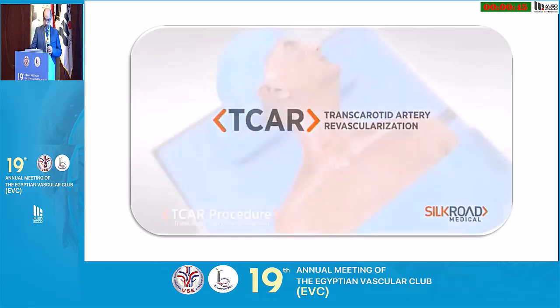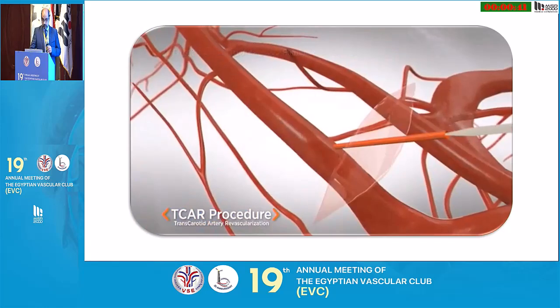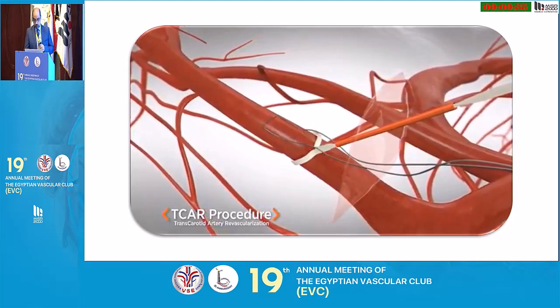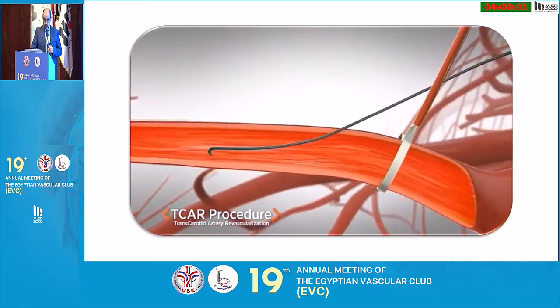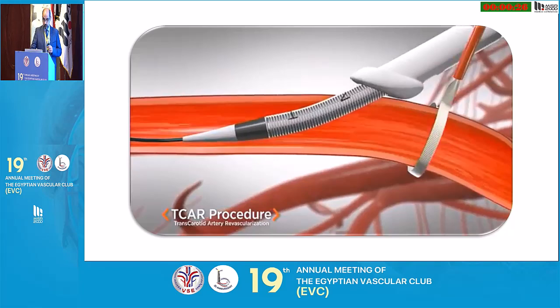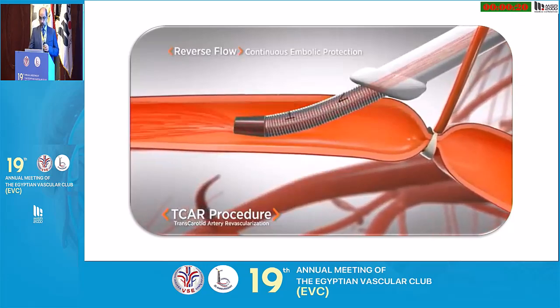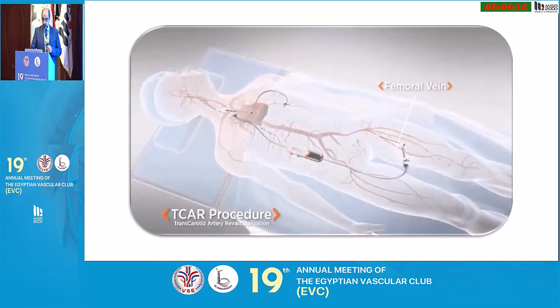This is a very small video of the process of the TCAR. Very small incision at the base of the neck, control of the common carotid, insertion of the sheath, closure of the common carotid, and start the flow reversal system directly to the femoral vein.